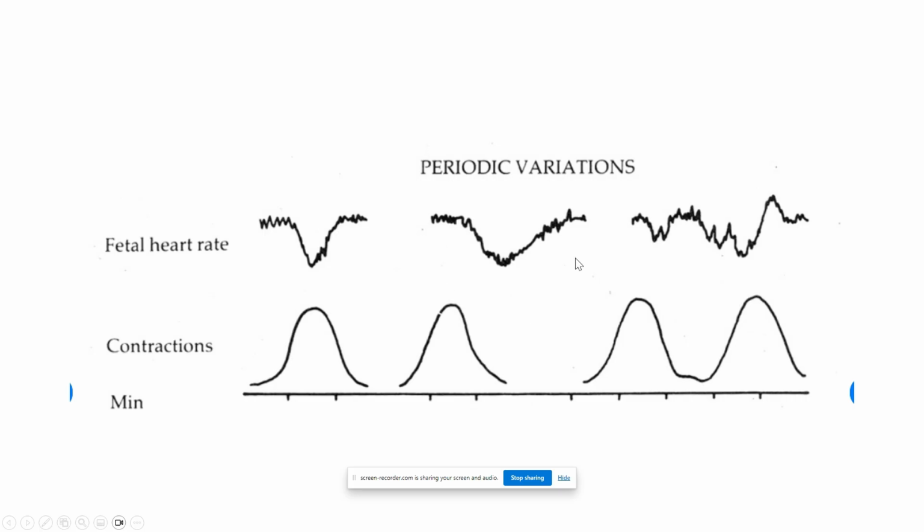So when it comes to a late deceleration, this is not a good thing, and we need to alert the doctor immediately. Now, when we see a late deceleration, there are three things you have to do first before you call the doctor. And this is extremely important, so please listen. If we see a late deceleration, which starts to drop after the peak of the contraction, the first thing you have to do, no matter what, is turn the mom on her left side.